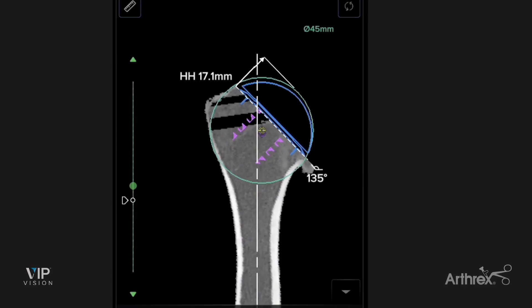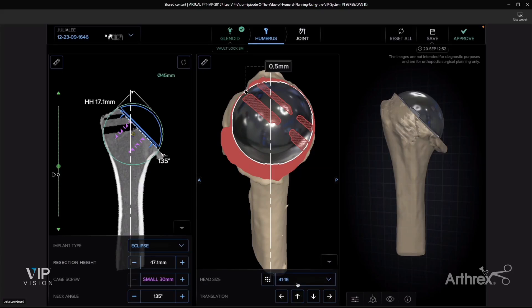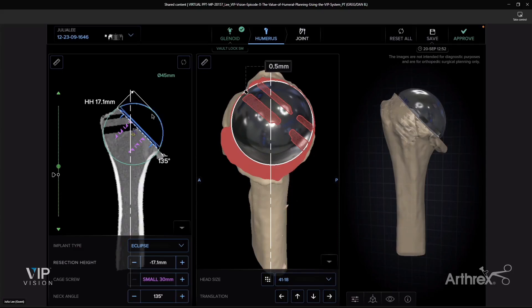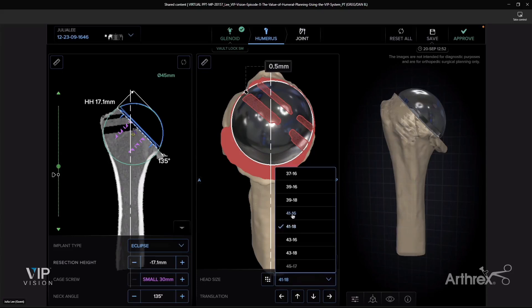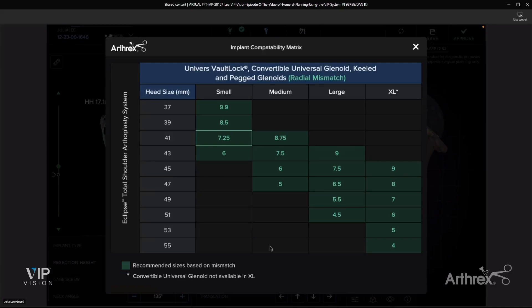As we all know, anything beyond 2.7 millimeters makes it where you're not restoring their anatomy appropriately. So I want to make sure those purple crosshairs better match the yellow. Changing the component position can help with that, and I think that looks really good. This is sized for a 41-millimeter trunnion, and I like that size. With the 41-millimeter trunnion, you have two different head options — a 41 by 16 and a 41 by 18 — and both of those restore that center of rotation rather well. I personally undersize these if I can, because I do not want to put extra tension on the patient's rotator cuff. They also have a nice chart showing radial mismatch between small, medium, large, and extra-large glenoid components and your humeral head size.